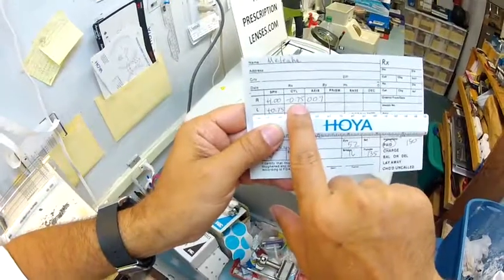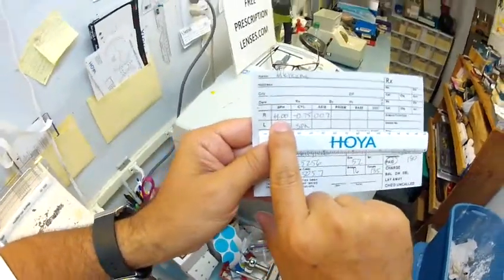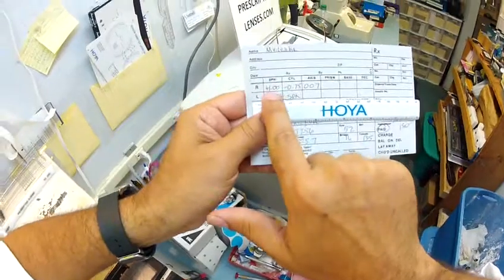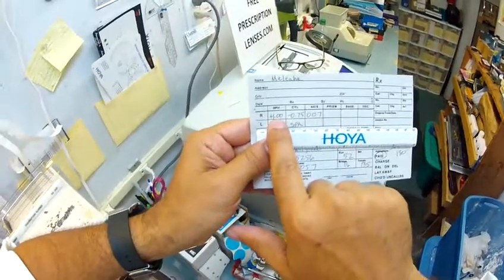Now you have a second curvature, which is your astigmatism. This first number makes everything the correct size. Without your glasses on, things are actually much smaller than they appear in real life. So when you put your glasses on, it magnifies 4 steps. You're on the 4th rung of a ladder to get everything the correct size.